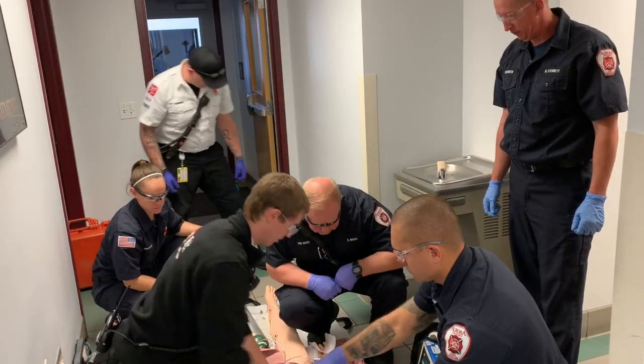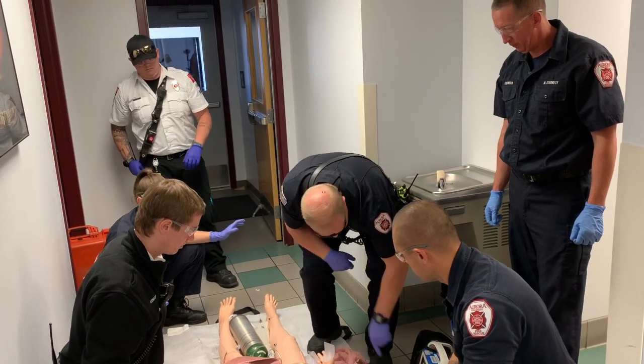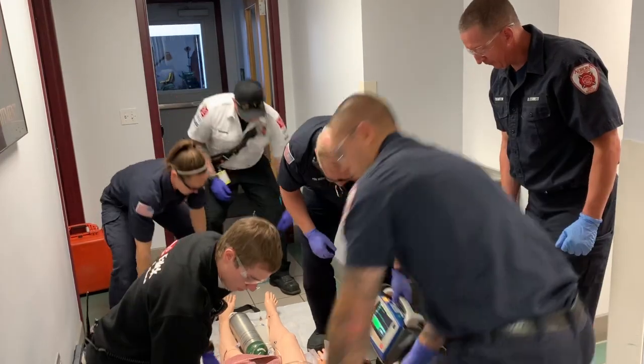Okay, stop CPR. Just get the bag, please. I'm in defib still. I'm clear, you're clear, everyone's clear. We're shocking. Okay, let's go ahead and move the patient to the stretcher.